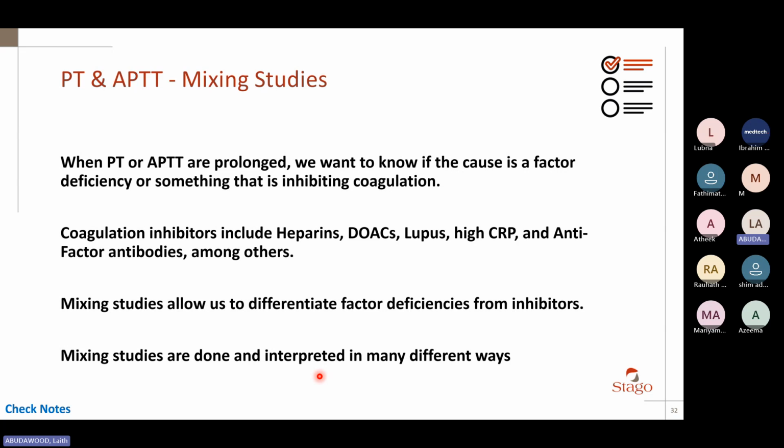So then how would I judge? How would I know? We have many ways. We have something called the Rosner's index. We have something called Chang's index. We have something called percent correction. We have cutoff values, etc. Which one is better so far? The ISTH recommends you best to use the Rosner's index. How does it work? A discussion that we can do at another time because it's a bit extensive as well. No time to discuss it at the moment.